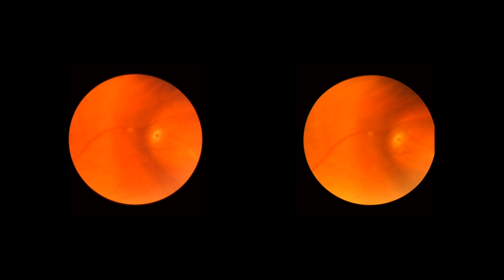This 38-year-old man was found to have this asymptomatic tractional tear in which the vitreoretinal traction had completely avulsed this tiny fragment of retina as a free operculum. Note how the examination and also the photography of this tiny lesion is made easier by scleral indentation.